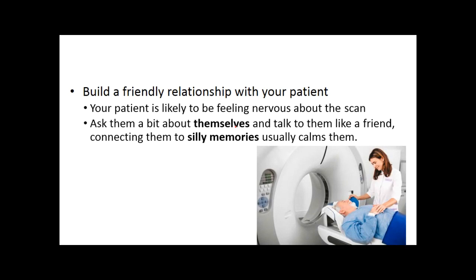To reduce their anxiety, ask them about themselves, like you are talking with a friend. Connect to them with their silly memories, okay, when they were a child, or when they went abroad, or when they were with a friend, and so on. This usually distracts them, takes them away from the procedure itself, and reduces their anxiety.